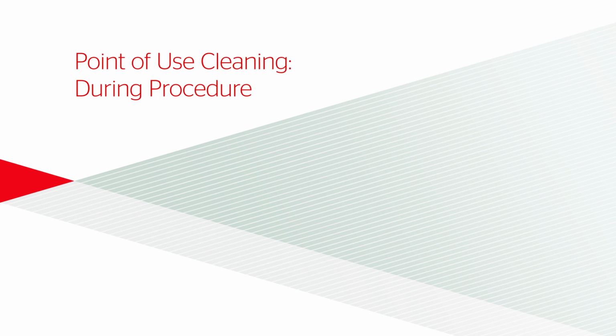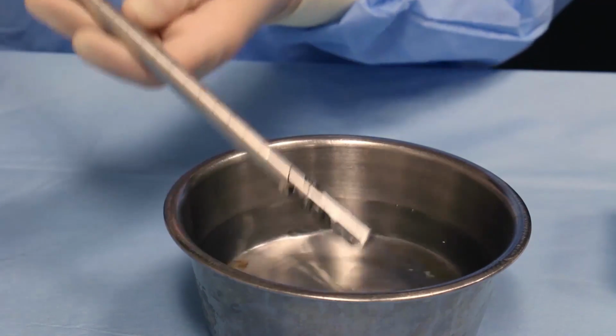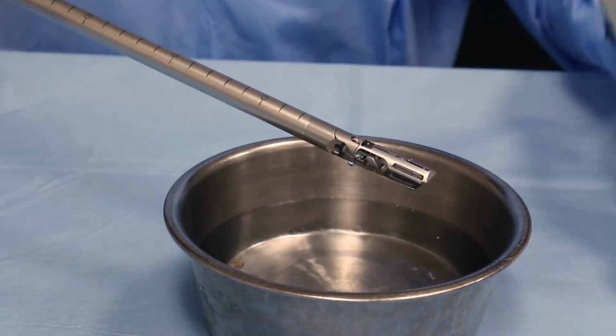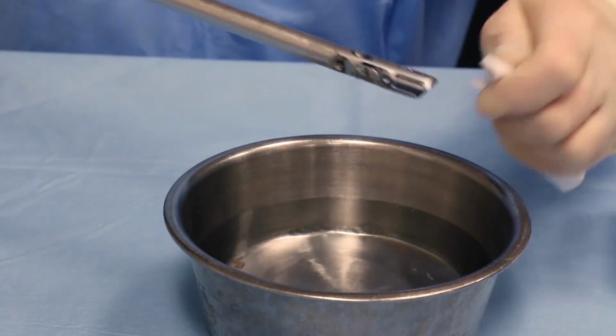Point of use cleaning during procedure. If the instrument will be reloaded with another suture cartridge, rinse the instrument in sterile water, then follow the steps to load a new cartridge.